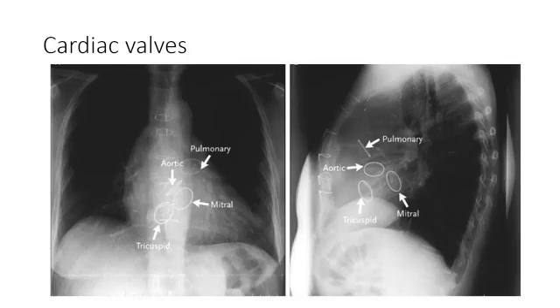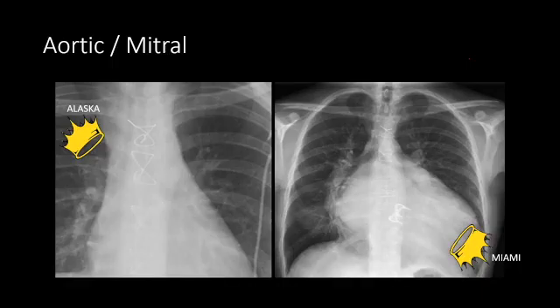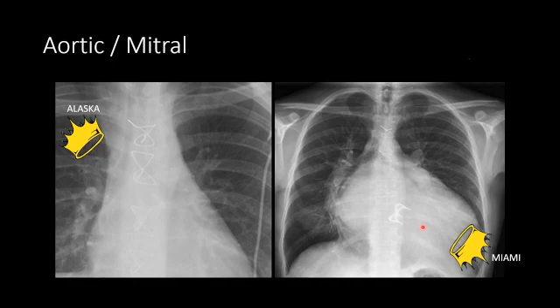This patient underwent median sternotomy and replacement of all four cardiac valves. It can be very difficult to tell these valves apart on a chest radiograph. It is much easier if the valves have a prong, as you can see in the next images. These are two different patients demonstrating aortic and mitral valve replacement, and when the valves have prongs it is much easier to identify them.